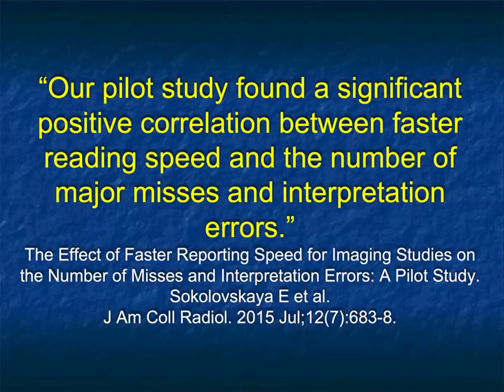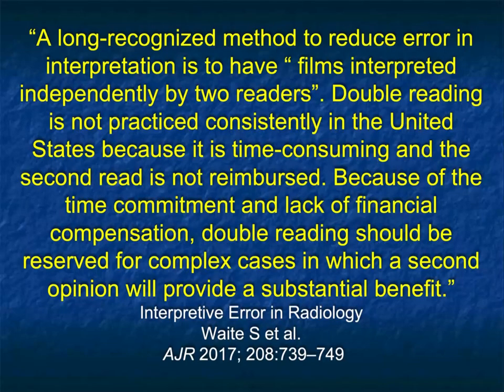In the same article, our pilot study found a significant positive correlation between faster reading speed and the number of major misses and interpretation error. So everyone, slow down, and if you're reading fast, please pay more attention. Again, reading fast and paying more attention seems to be in conflict because you need to spend X amount of time looking at a case.